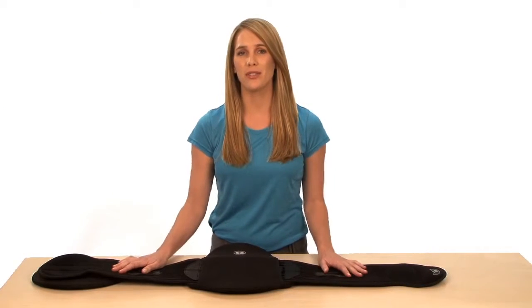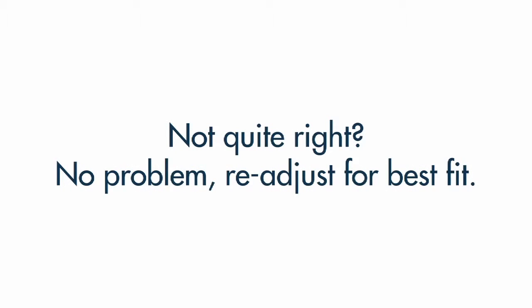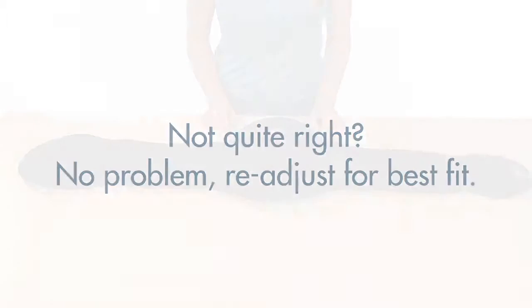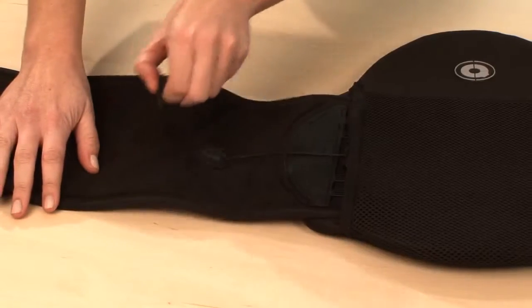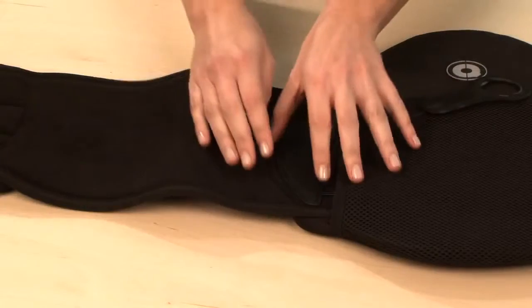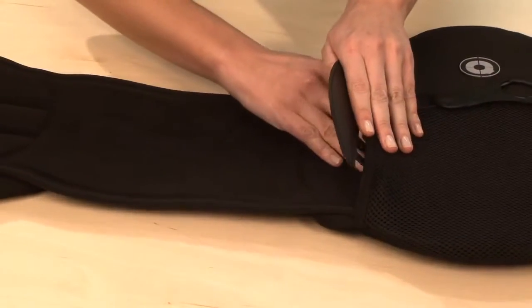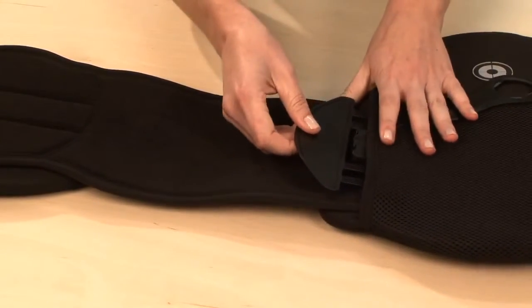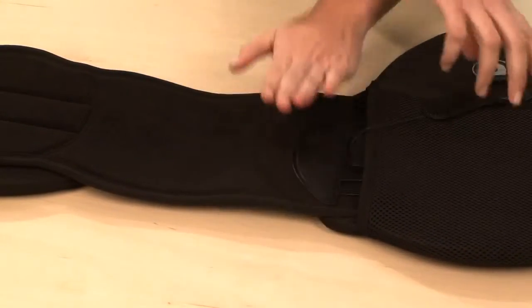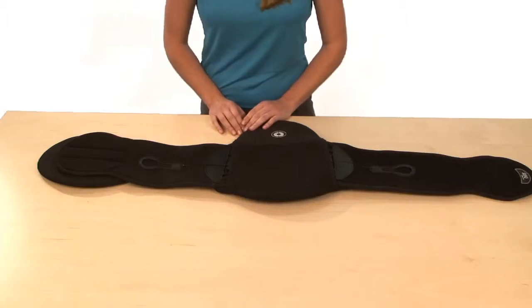Now your Sleek is ready for use. Decreasing the circumference of your Sleek: simply lift up on the ComfoGuide pull tab, lift up on the crescent connector, feed the wing back in anywhere within the sizing arc range, and attach the crescent connector and secure it. Do the same with the ComfoGuide pull tab. Simple as that.